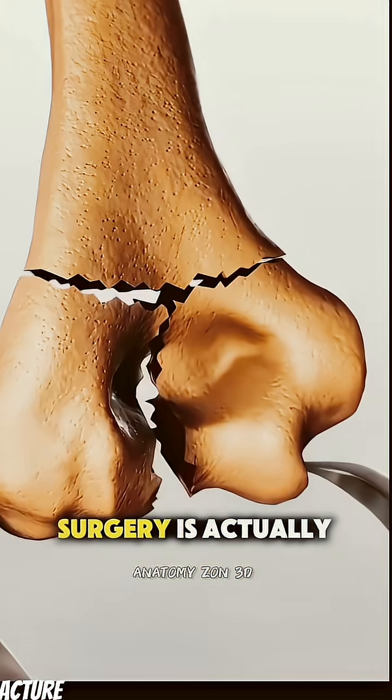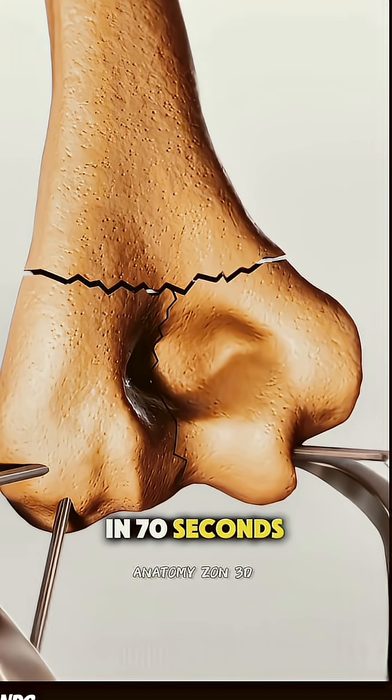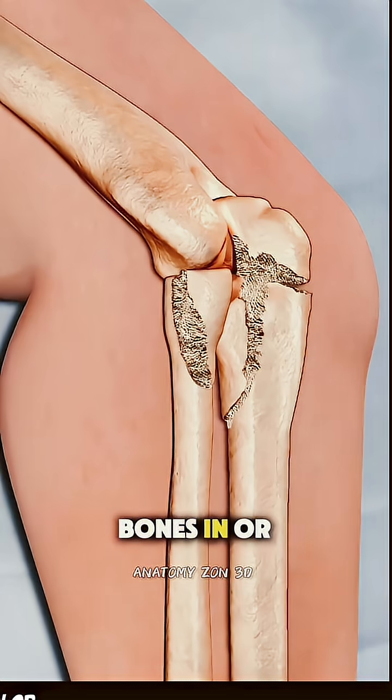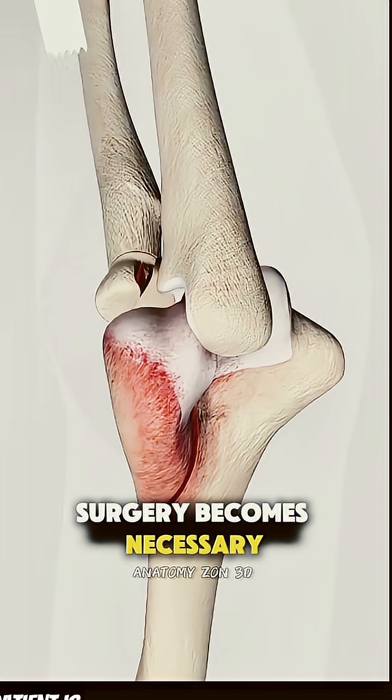Ever wondered how elbow fracture surgery is actually performed? Let me walk you through it in 70 seconds. When someone fractures their elbow badly, like breaking the bones in or around the joint, and it can't heal properly on its own, surgery becomes necessary.